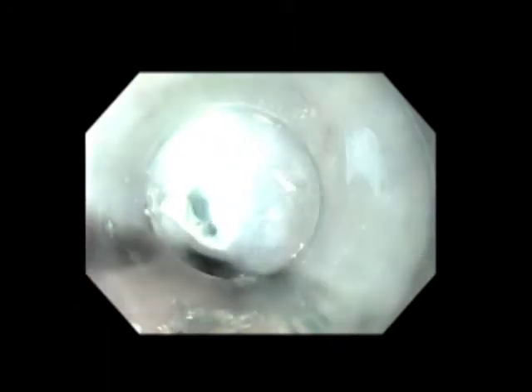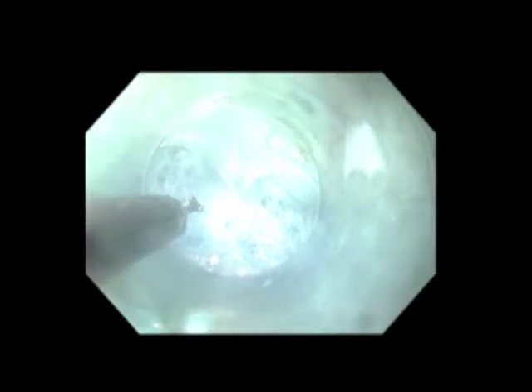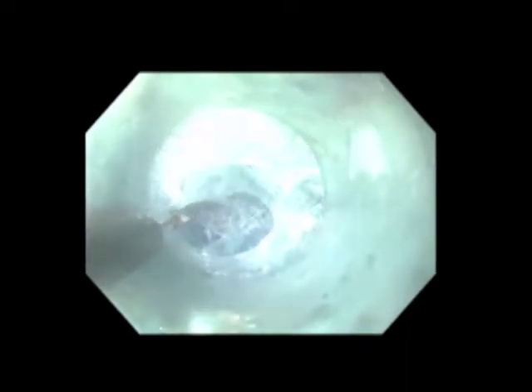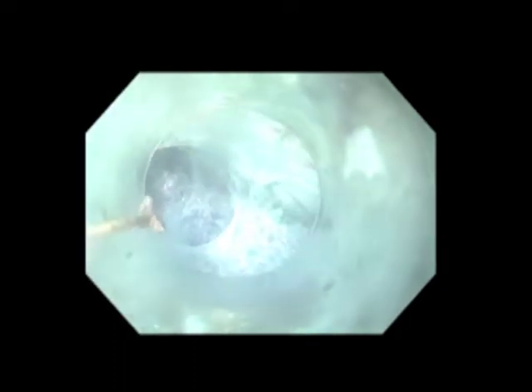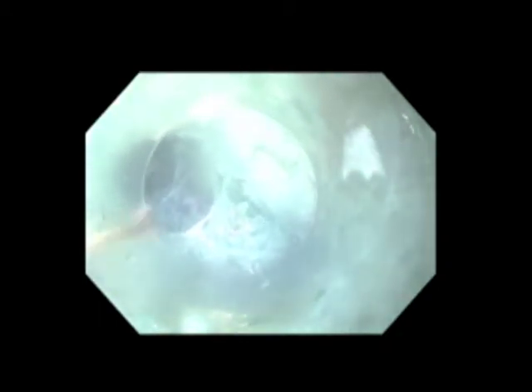The scope is fitted with a transparent dissecting cap, which you can see around the perimeter of the image, which is used to bluntly maneuver the scope through this mucosotomy and into the submucosal space. Once inside the submucosal space, a combination of blunt and electrocautery dissection is used to create a longitudinal tunnel down the length of the esophagus and onto the gastric wall. Here we can see the circular muscle fibers of the esophagus towards the top of the scope view, the loose areolar tissue towards the middle, and the mucosa towards the bottom. Care is taken during this dissection to stay towards the muscle side to avoid inadvertent perforations of the mucosa.